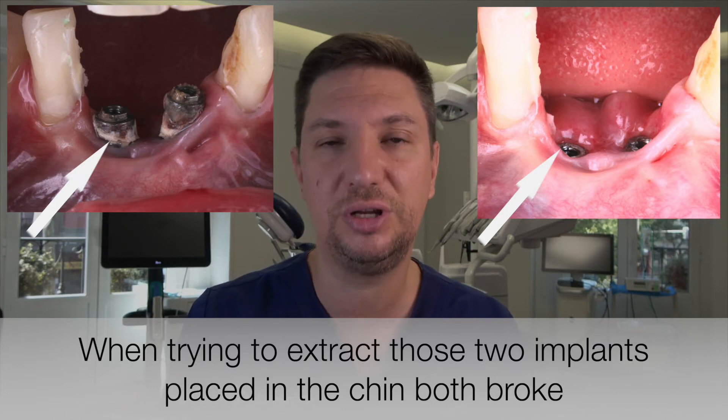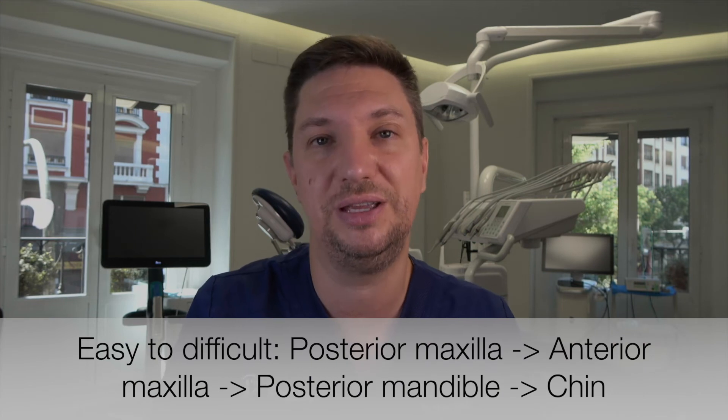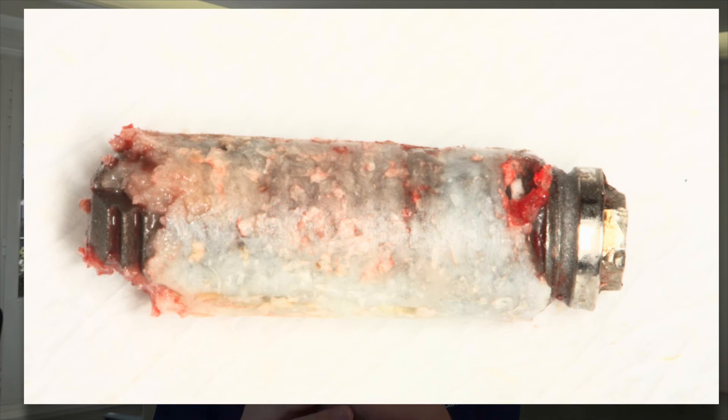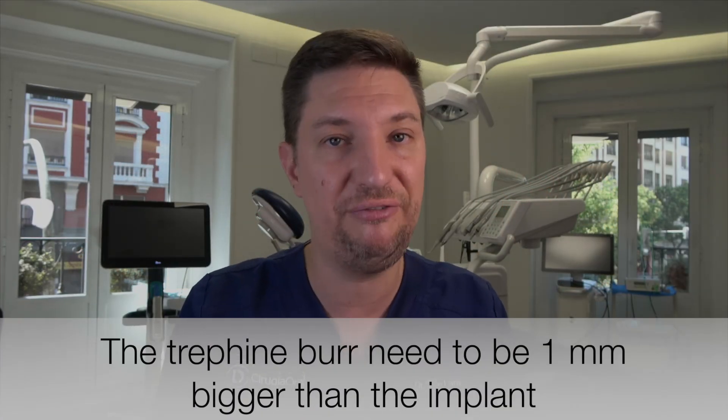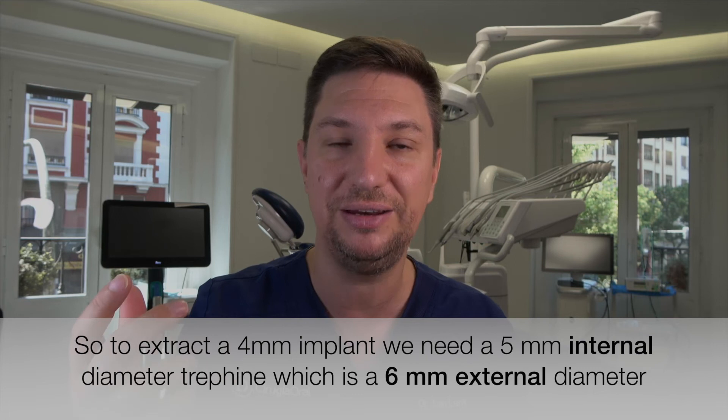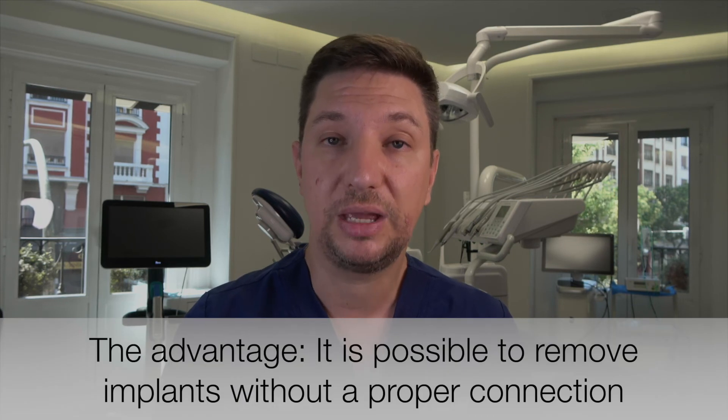Maybe in the maxilla it will be easier, but not in the mandible. The second way to remove an implant is using the trephine bur. The trephine cuts only on the sides and gives you a cylinder. We need a trephine that is at least one millimeter bigger than the implant. So if we have a four millimeter diameter implant, we need an internal diameter trephine of five millimeters, meaning the external diameter will be six millimeters. Imagine the bone defect that leaves — a hole of six millimeters, which is a really big bone defect.